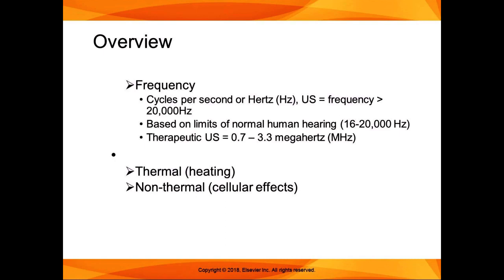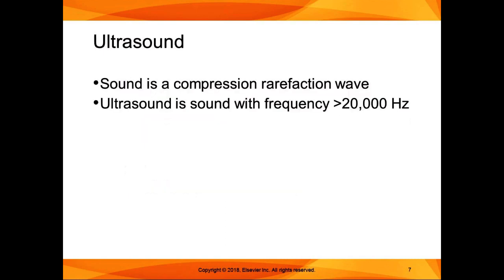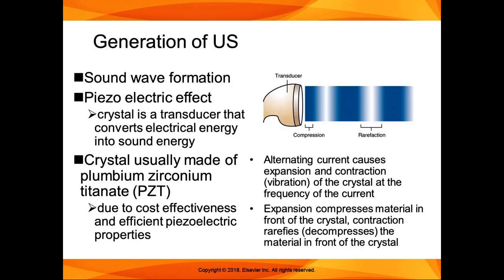It's kind of interesting that we started out with an application which was pretty superficial, and then we end up with something that has cellular effects. So pretty interesting. It's that compression rarefaction wave, and it's sound with frequency greater than 20,000 hertz. And the therapeutic levels we are talking about are way up there in the 700,000 to 3 million range.